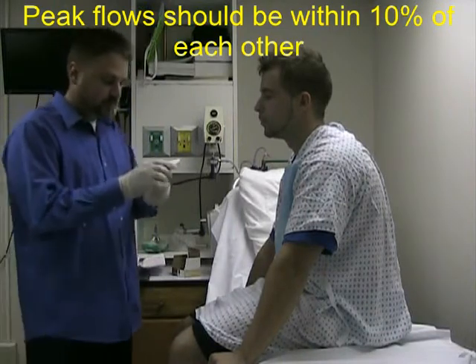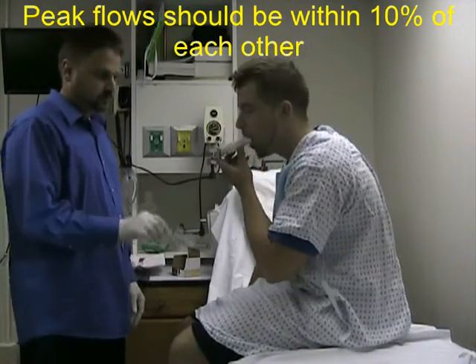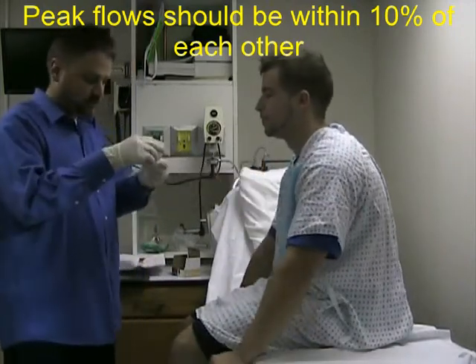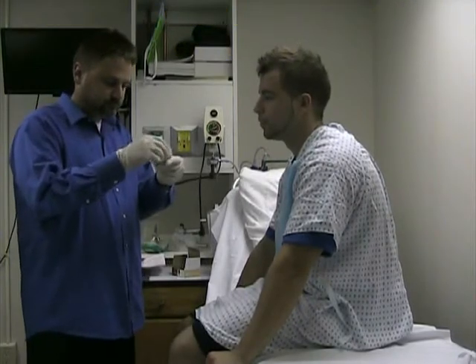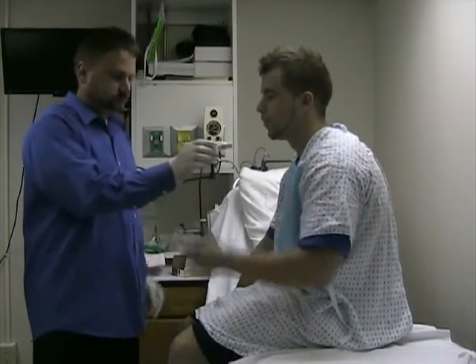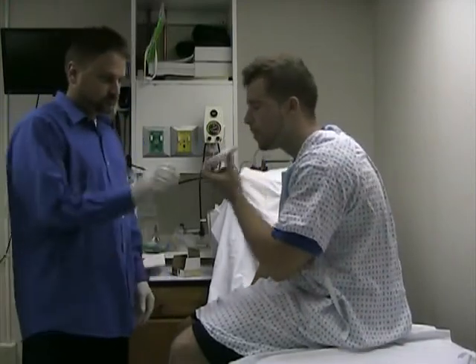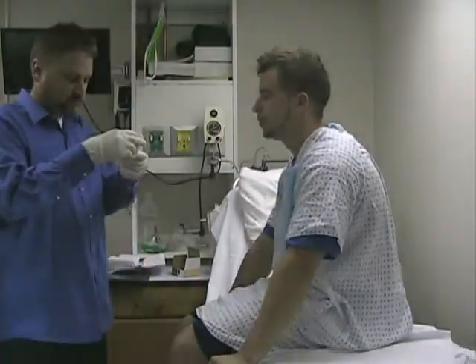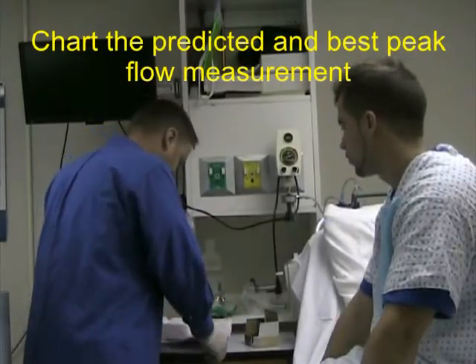Have the patient do it again — you're at 550. And a third time. Record the best peak flow on the patient's chart.